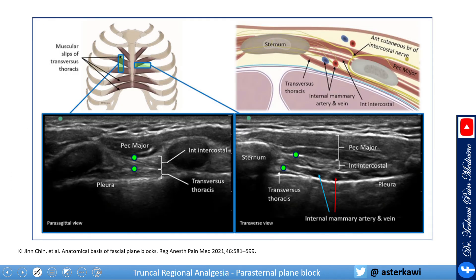Here is another picture. With the transverse probe, you can see the vasculature, and the nerve should be located around that area. In the parasagittal view, the target for the superficial block is right there, and for the deep block it will be right here.